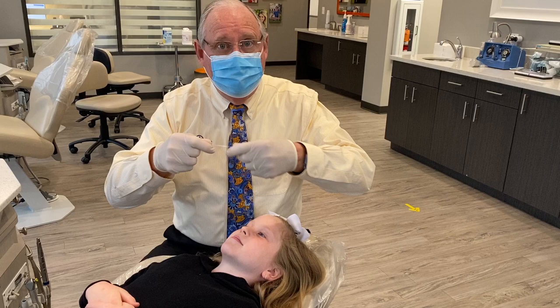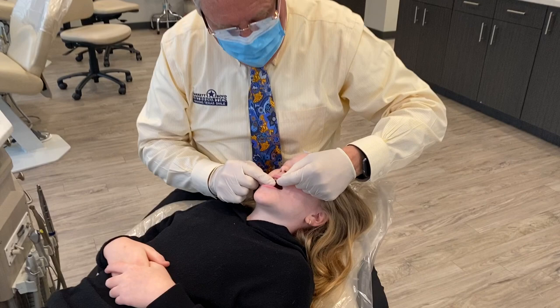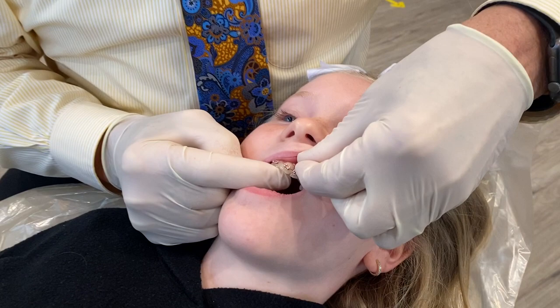But let me show you a couple of tricks. Standard floss dealing with braces — when we try to go between the teeth, the floss will not go past the wire. So it's extremely hard to floss teeth, especially in the back.